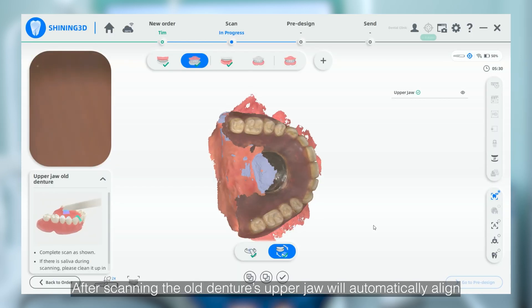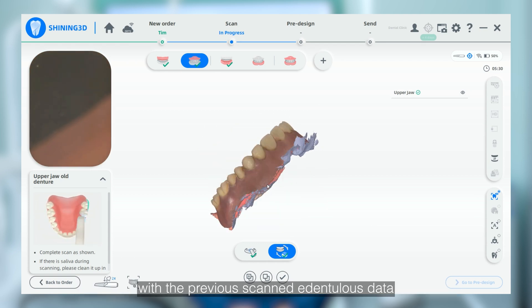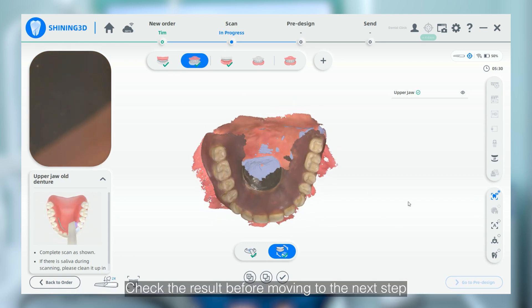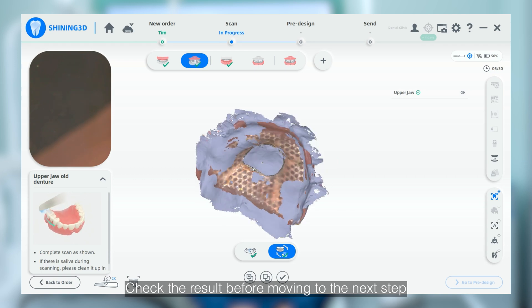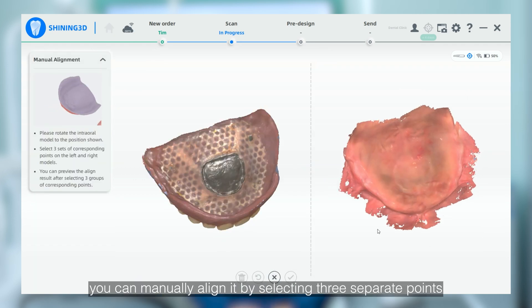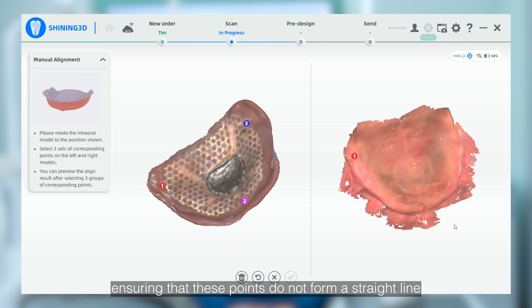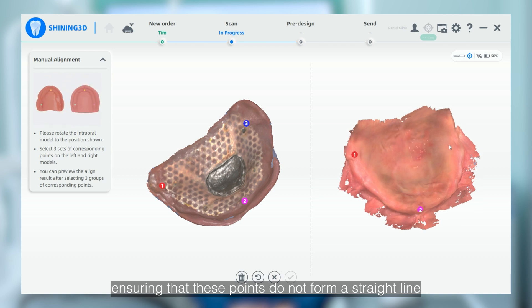After scanning, the old denture's upper jaw will automatically align with the previously scanned edentulous data. Check the result before moving to the next step. If the alignment is not accurate, you can manually align it by selecting three separate points on both the upper jaw and the old denture, ensuring that these points do not form a straight line.